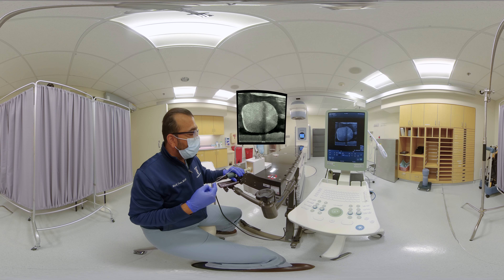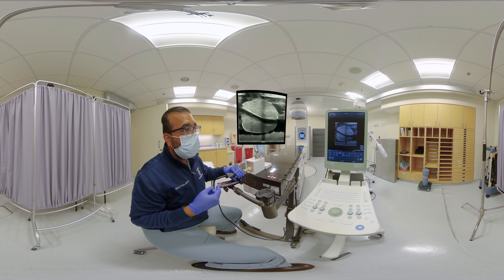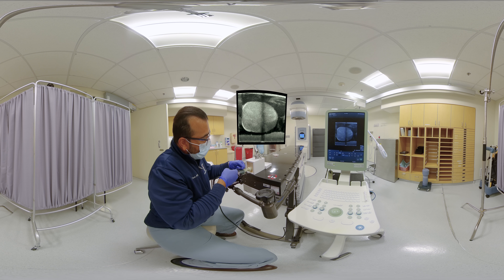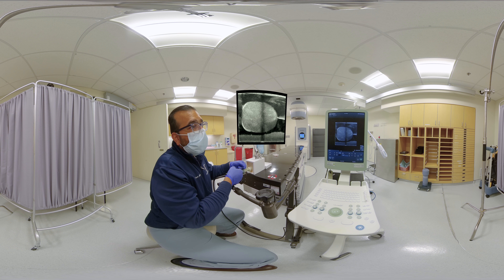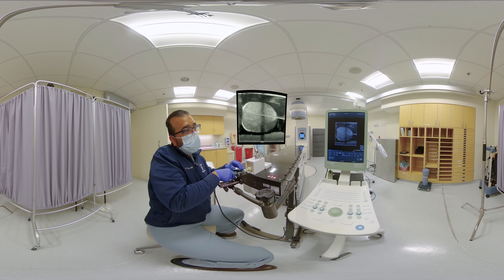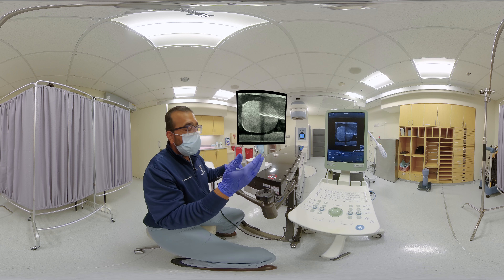Follow the same path and you don't have to move the ultrasound as you did previously. Our needle's at the apex — advance just into the apex and retract; the bevel edge is at or near the apex if you choose. Deploy and come out. Now rock or rotate back the ultrasound to the midline and to the contralateral side and repeat inserting your last fiducial marker. You can do this anywhere in the mid-gland. Follow your imaginary line just off the midline. Drive or advance your needle straight into the prostate mid-gland with your urethra out of view. You can see the needle is not perfectly in plane here, so we'll rock the ultrasound or you can sweep the needle to find the needle tip. Here is the needle tip in perfect view, and then you can deploy your fiducial marker.